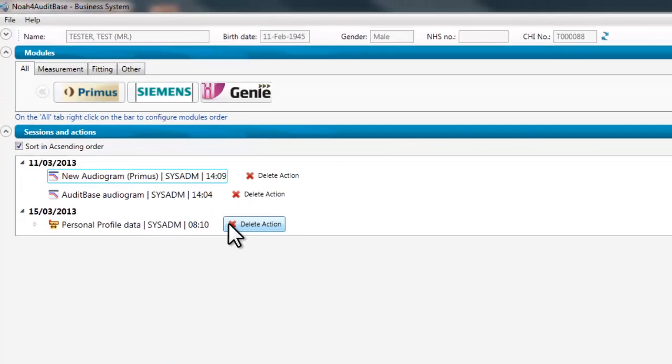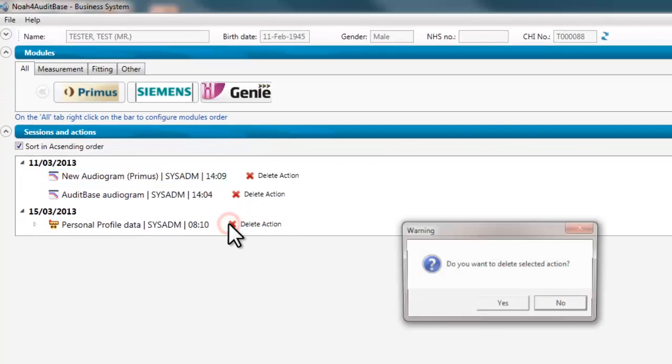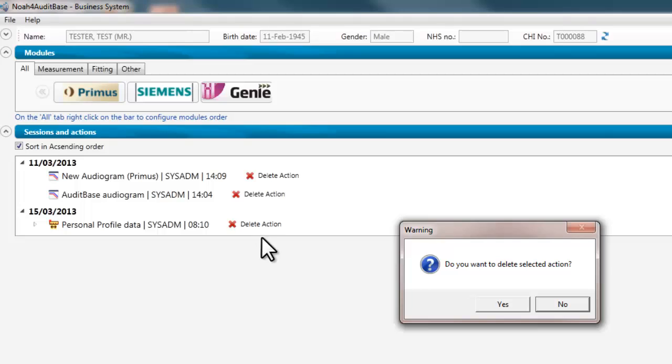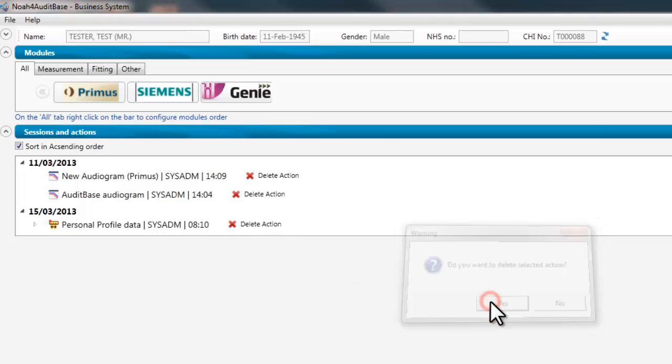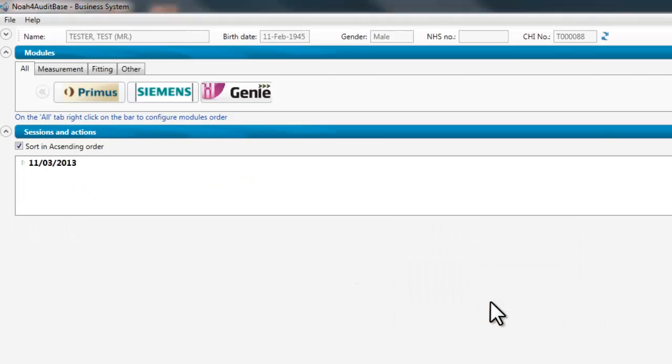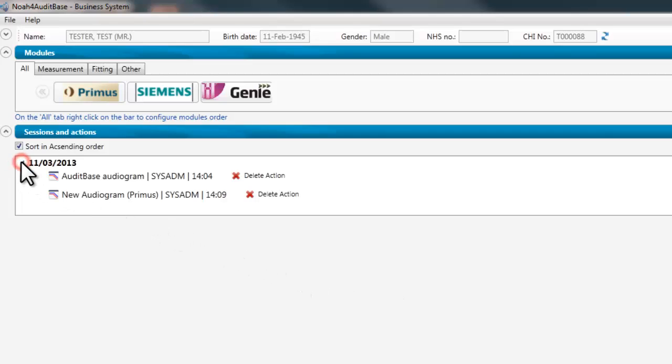An action can also be deleted by clicking the delete action button shown at the end of each action. You will be asked to confirm that you wish to delete the chosen action, and when confirmation is given the action will disappear from the list, leaving the remaining sessions and actions on display.